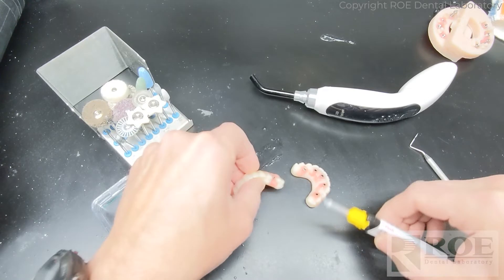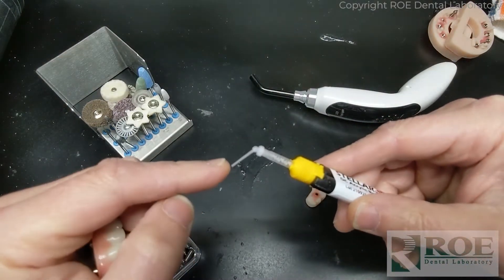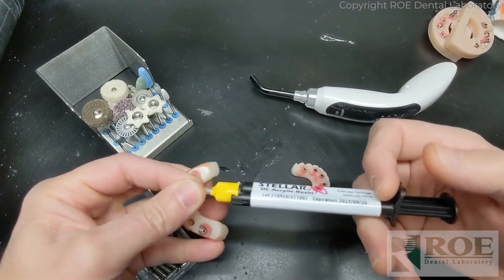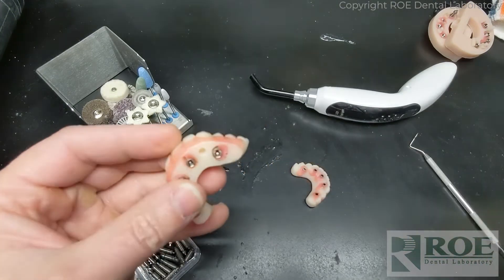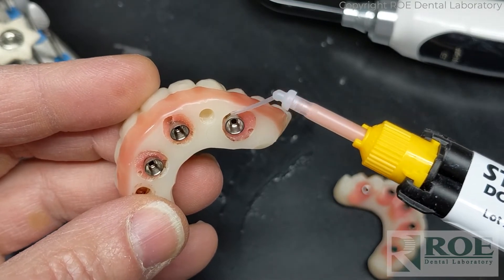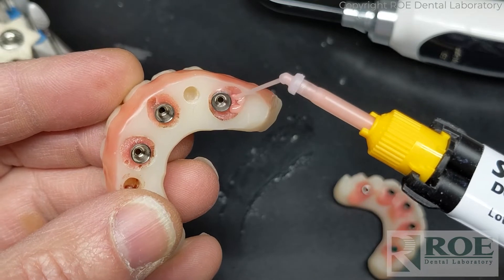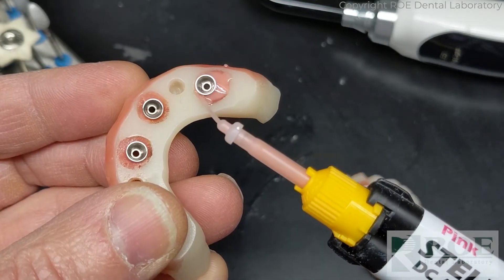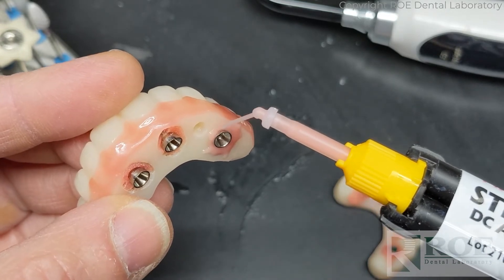The first step is to fill the holes. I like to use this composite or endo tip - it's got a very small micro head and it's easy to get into the gaps. You may need to use your block-out rods if there are any gaps between the temp cylinder and the prosthetic. In this case, I don't believe there were any gaps, so just backfill it. You can see this little void there - it's really easy to get the tip in.